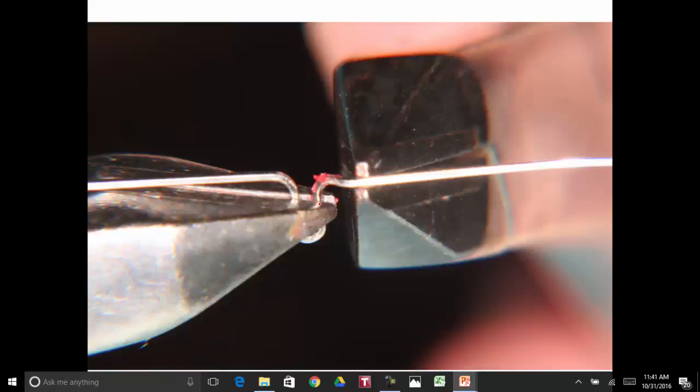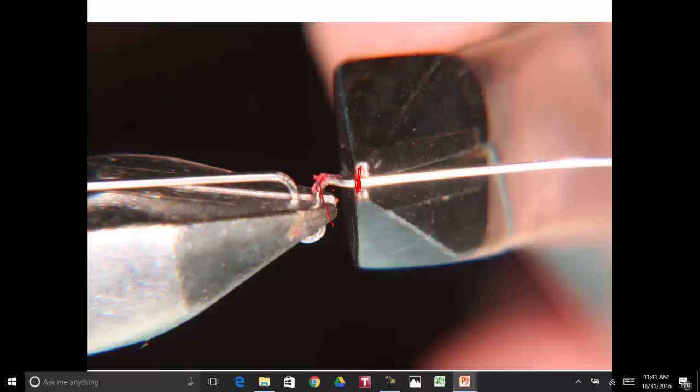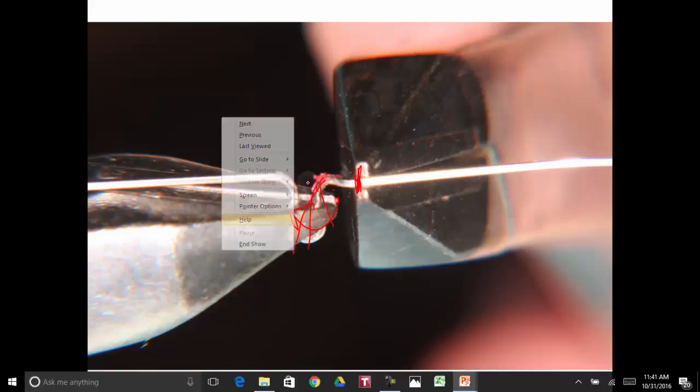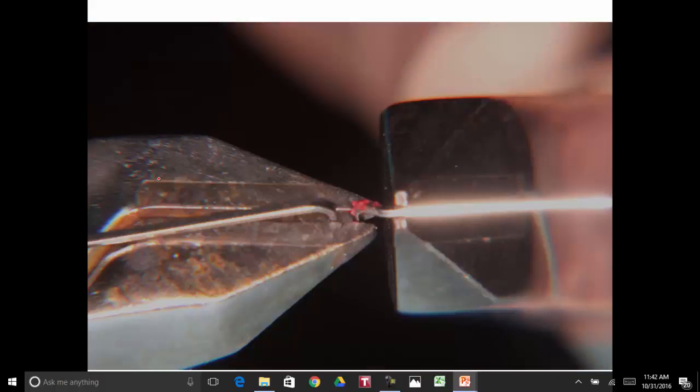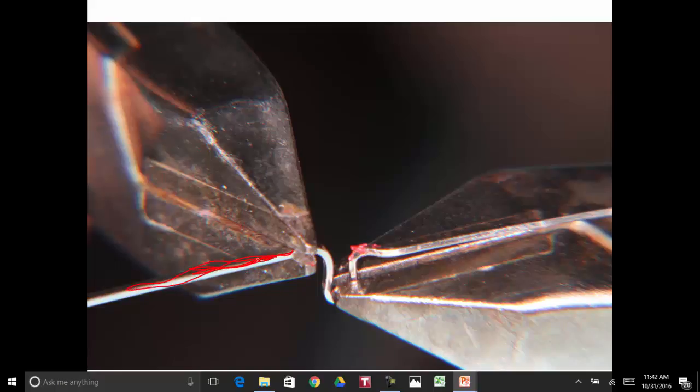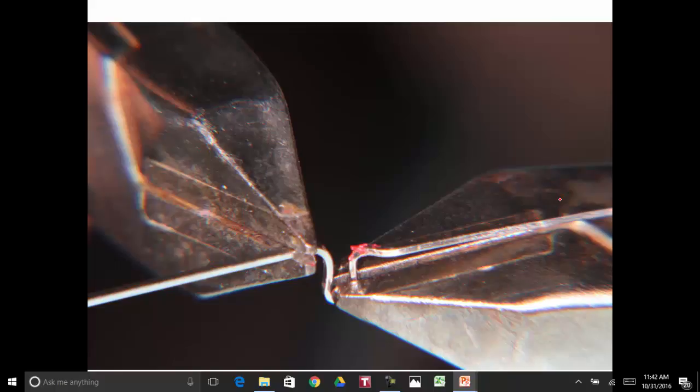Okay, there we come in. If you want to roll this omega out, maybe it's poking the tissue up there, so we roll them out frequently. You grab the archwire here to keep from torquing that. You come over to the omega and roll it out this way. In other words, it'll be set out to the side a little and coming back into the archwire, and then you take the torque out that you put in there. Now we rolled it out, and now we catch it on the other side and flatten this back out so that the torque in this part of the archwire and this part is the same if that's what you want. You may want to have buccal root torque. You can add it here, or you can add torque to this other portion of the archwire if you need to.